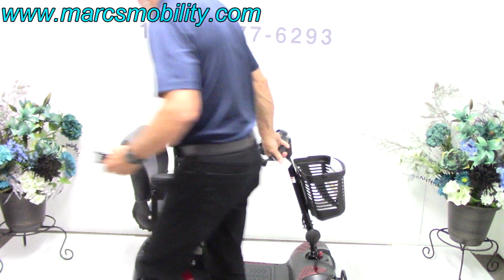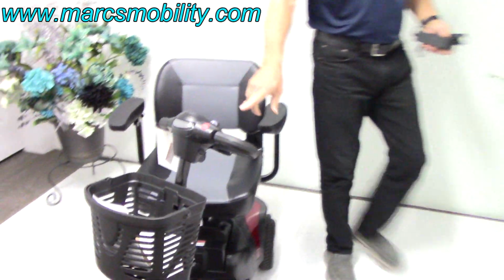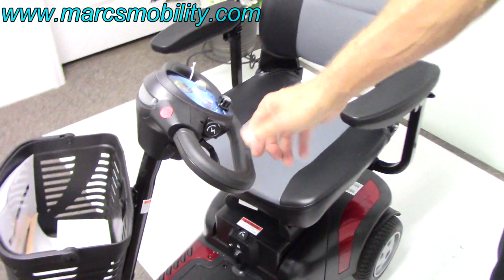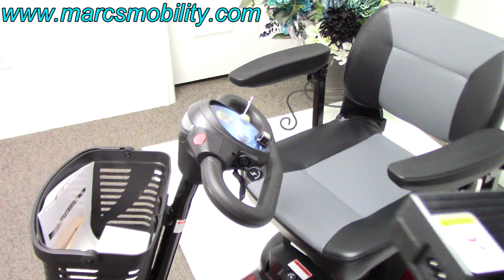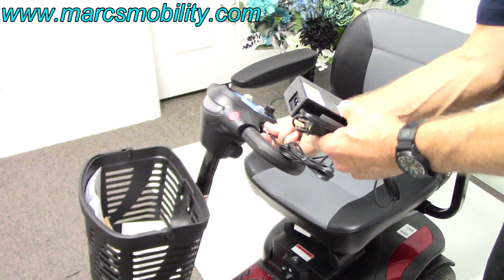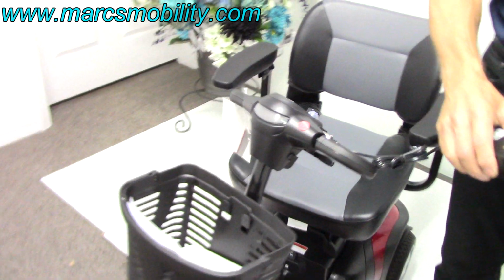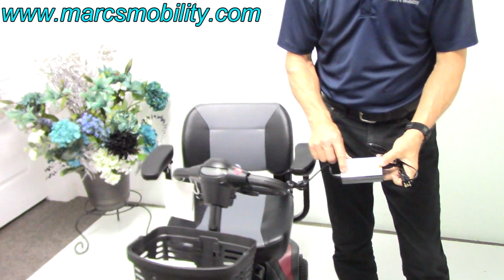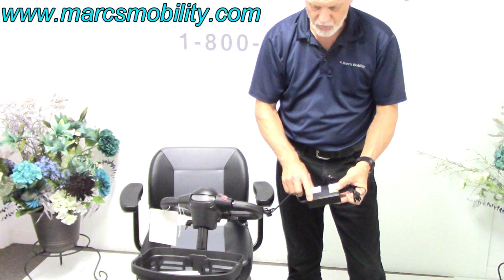Now when you charge the scooter, I'm going to show you right there, the charging port is on the left side of the tiller. So flip this down, then you would plug your charger right here. You'll feel it when it goes in. And then plug this into the wall, of course. And this part into the wall. When the light goes from red to green, you're fully charged. It'll be red when it's charging, green when it's full.